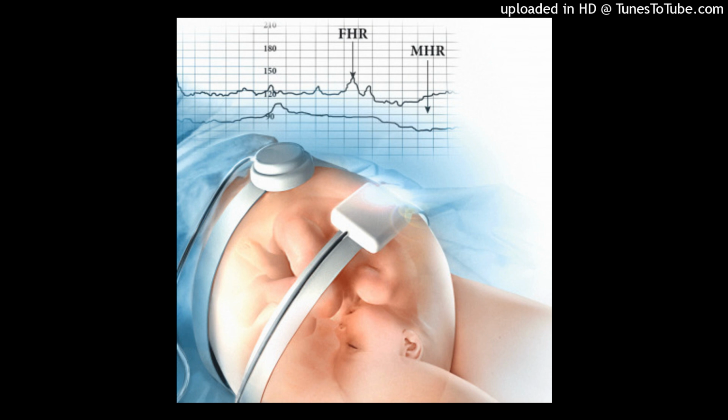Sinusoidal patterns are excluded from the definition of variability because this pattern is characterized by FHR fluctuations that are regular in amplitude and frequency. This pattern appears as a visually apparent, smooth, sine wave-like undulating pattern in the FHR baseline with a cycle frequency of 3 to 5 per minute that persists for 20 minutes or more.